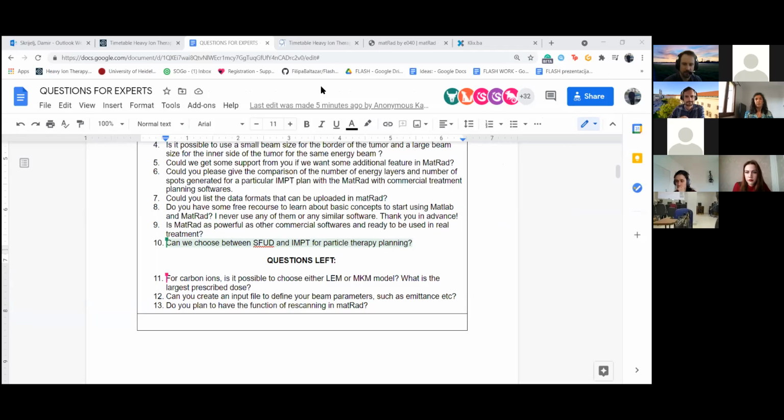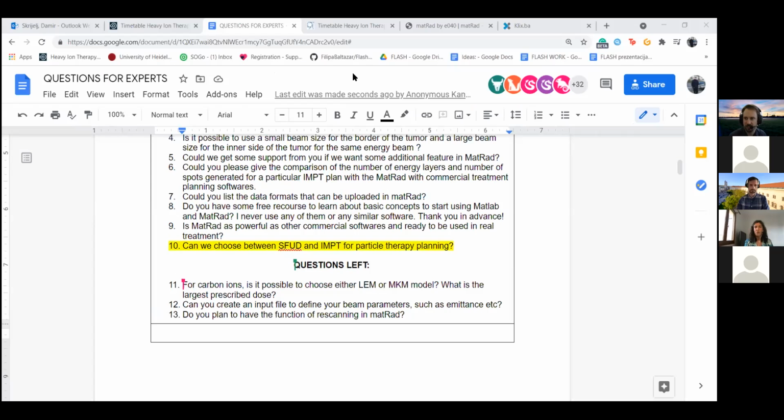For example, maybe you have an MKM scorer integrated into a Monte Carlo dose calculation that is able to score the alpha parameter times dose and the beta parameter times dose squared. Then you can directly use it with the matRad optimization. But the model itself is not there.